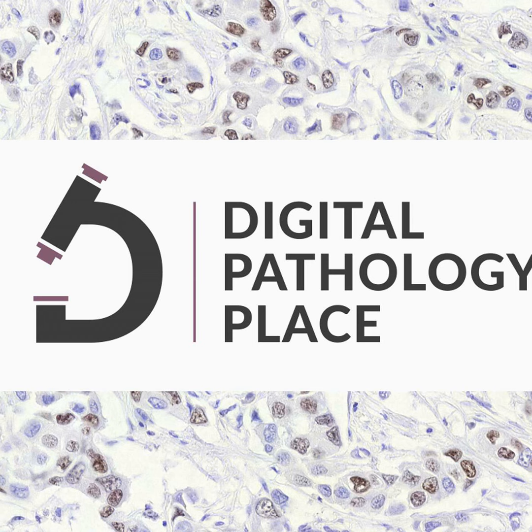So we have to think about it at a much higher level now, that the technology that we need is looking not just at the study level, but at the series level and the image level. It actually gets far more complicated. And that's just the first part of getting the data to the AI. You also mentioned getting the data back. Now, once you send data to the AI system, right now, all we're doing is sending it back to our PAC system. But that is not necessarily the future.